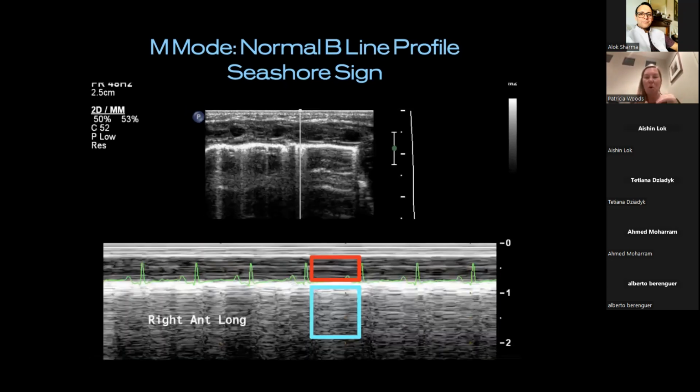It's a little more obvious when you have more B lines around. So A lines can be a little tricky in really hyperinflated lung. Now, if you come to one with more of a coalescent B profile, there's just a lot more contrast, a lot more sand involved, and you can pick it instantly. Yep, there's a pleural line, those are spaces. Yes, the pattern changes as you cross that line, the pleural line with time.